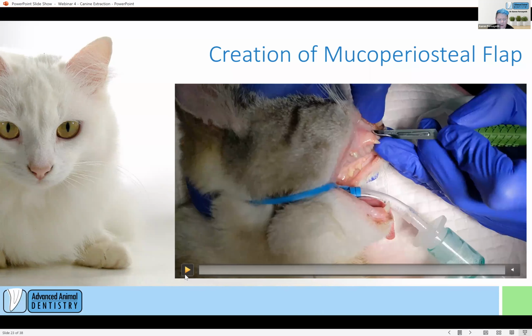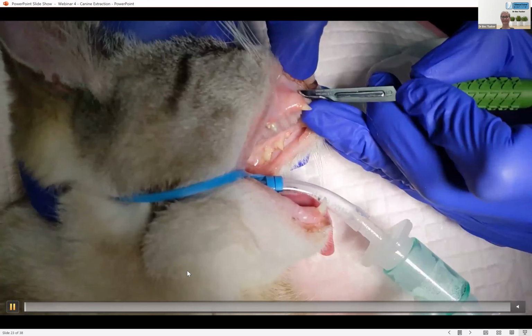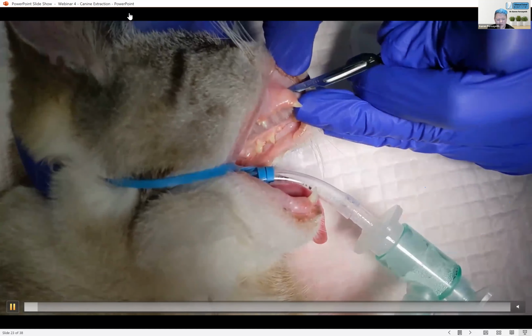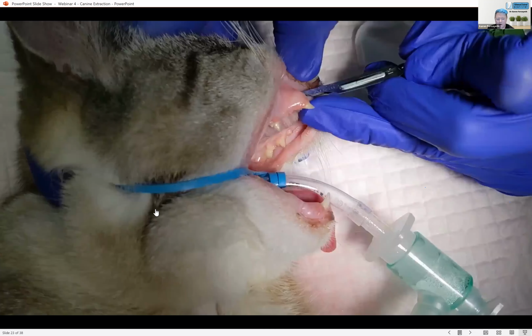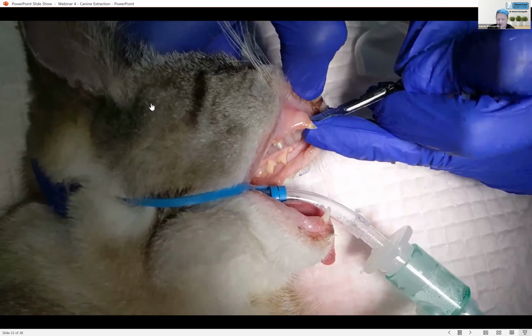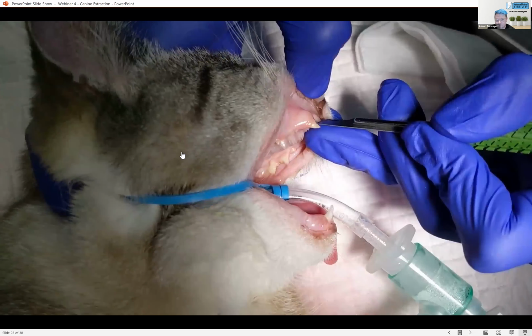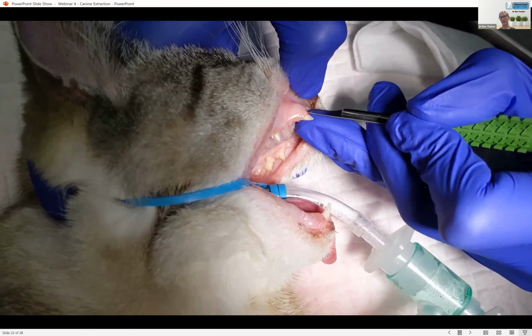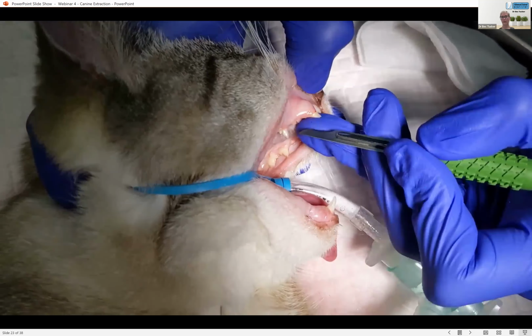Now, the still photographs that you're going to see are from one side, and the movie film vision is from the other side. So I guess we'll try and whip through this so we don't keep you forever as well. Again, thank you for your attendance. Good to see everyone still paying very high attendance. And again, that little incision on the corner just to flick the corner up.